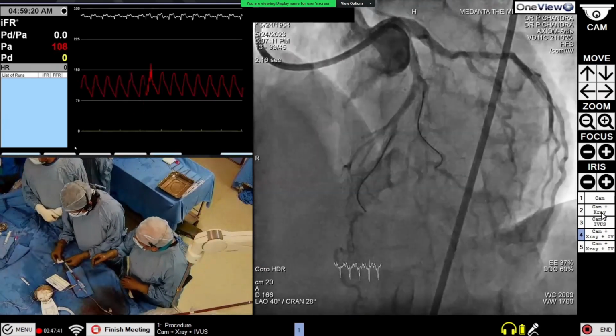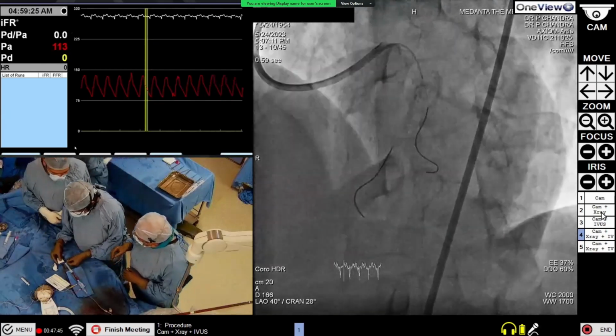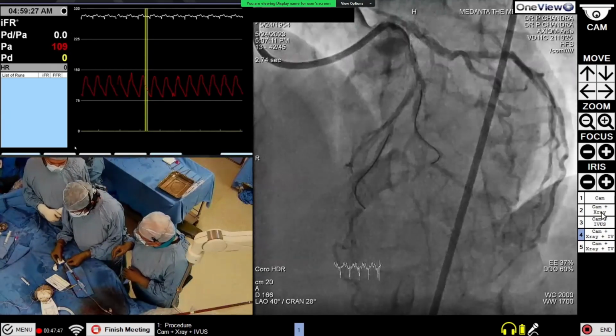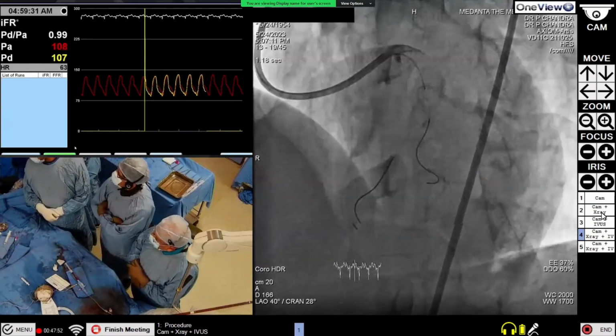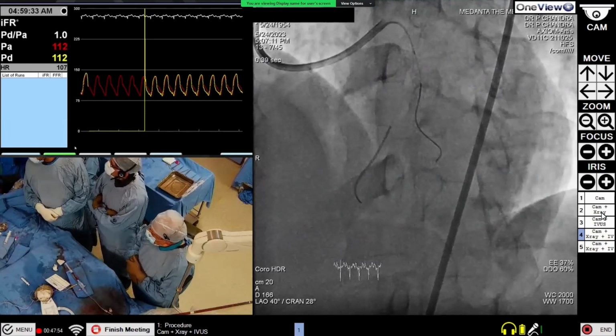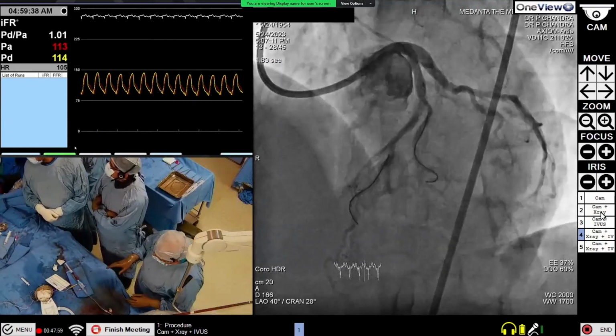It's attached. No, it just came. Yeah, it's okay. Fine. Absolutely perfect. The flow is really good. Absolutely nice and save frame.